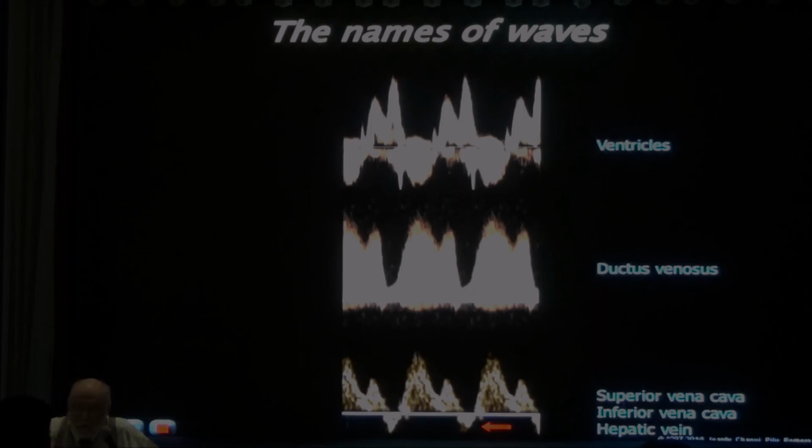The baby has squeezed the blood into the aorta, it's moving into the aorta, and the normal pressure comes back and closes the aortic valve. And this is the semilunar valve closure over here, okay? So this is a click that tells you this is the aortic valve closure.